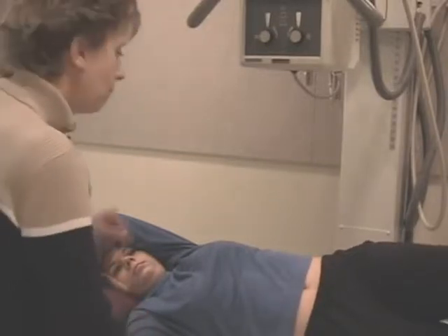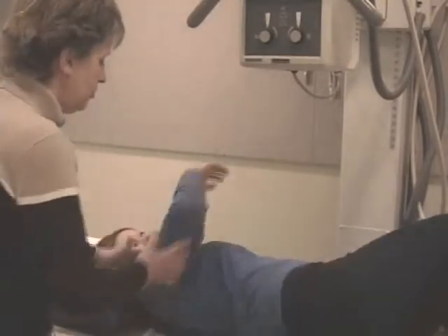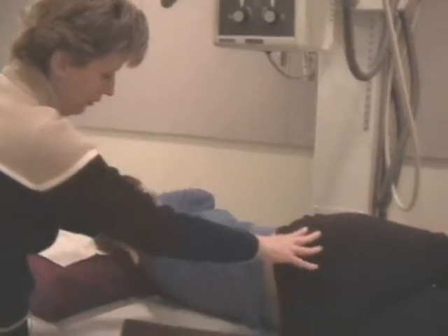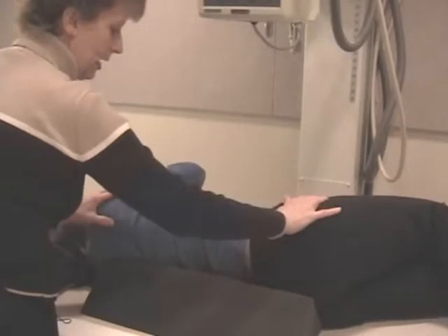Okay? You would do an LPO. Have your patient reach across her shoulders. That knee would come up. Notice how her hips and her shoulders aren't at the same plane and she's a little crooked. So we're going to adjust her, get her straight, use the sponge, and let her relax down.